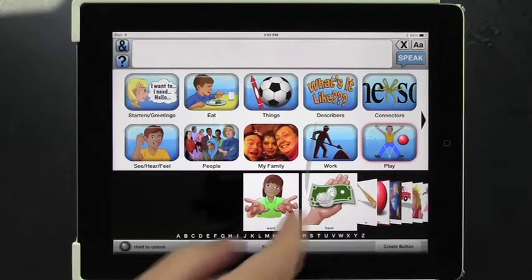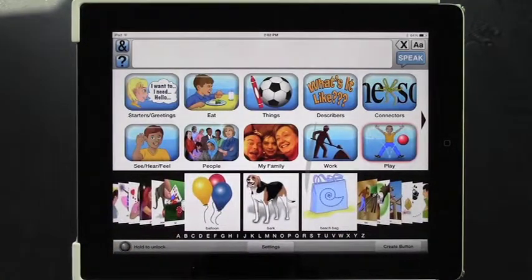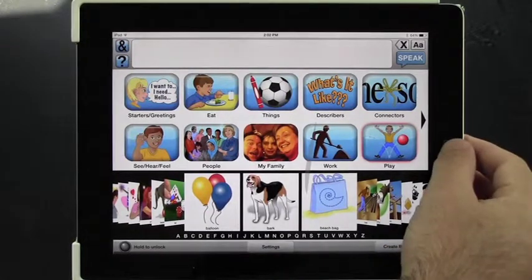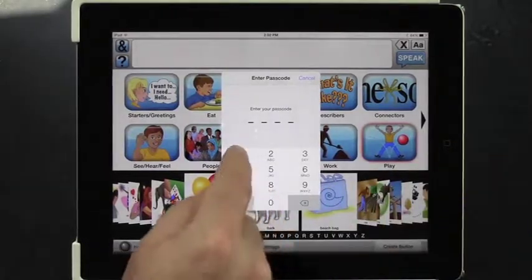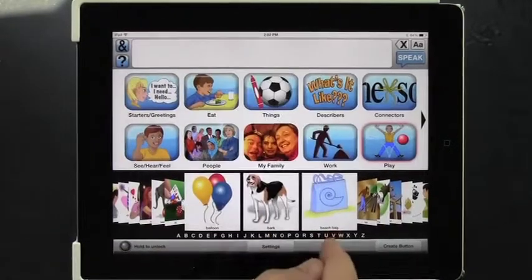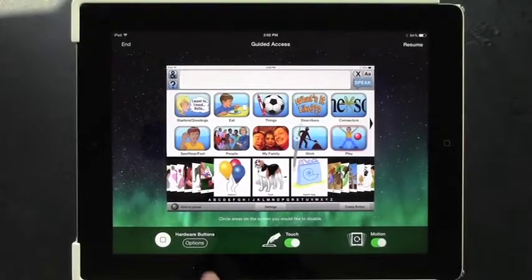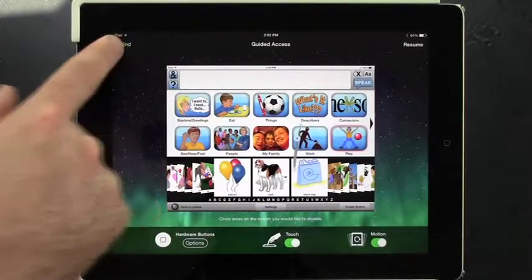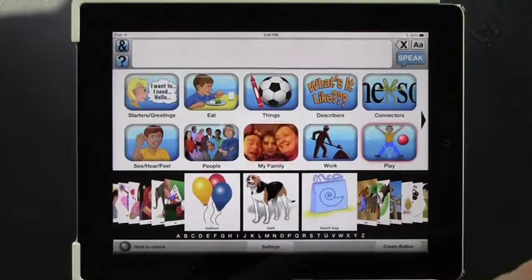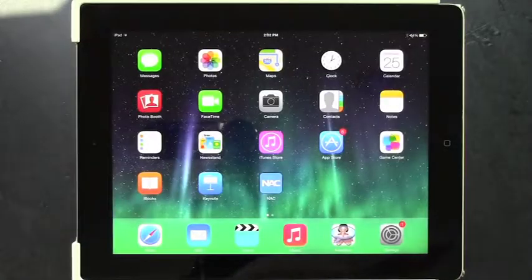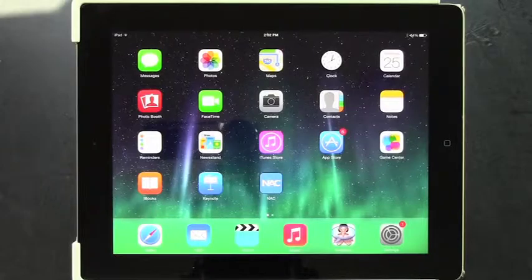So this keeps the child on task while they're using AvaTalker AAC. In order to deactivate this feature, triple click on the home key, enter your passcode, and click End at the top. Guided Access ended — you can exit and use other apps. So that's it: your quick tip for Guided Access in AvaTalker AAC.